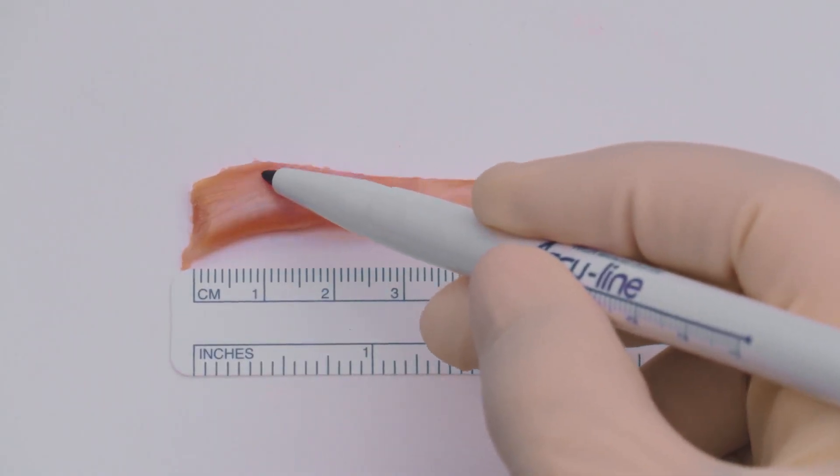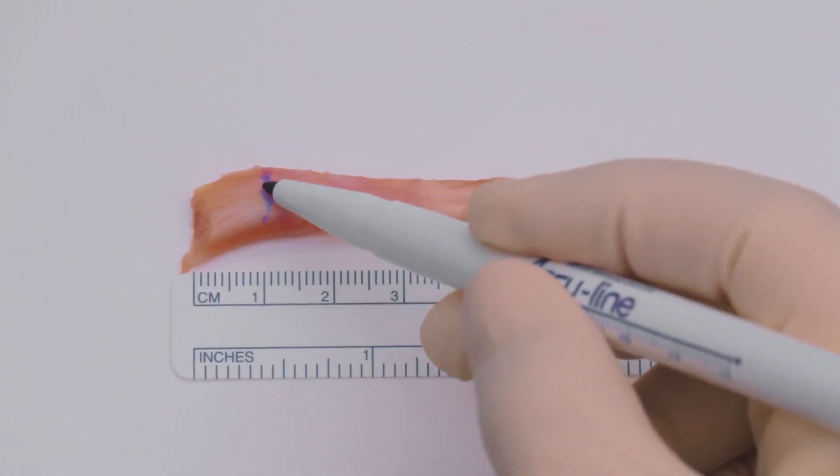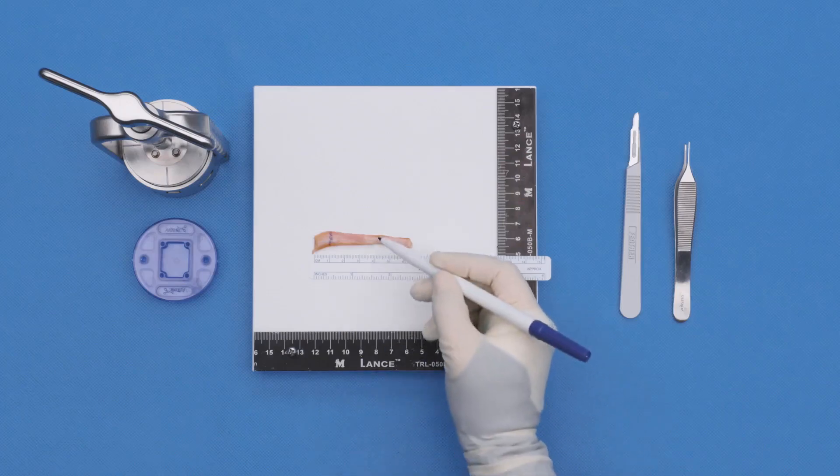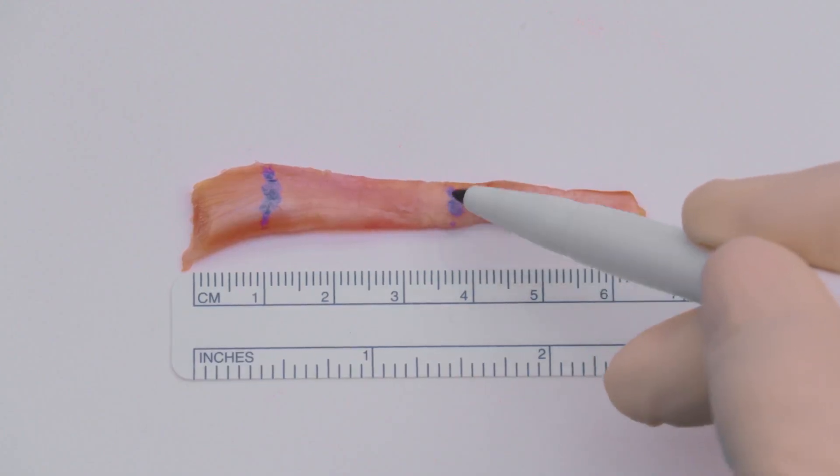For the graft, harvest the biceps tendon through either a super-pec or sub-pec approach. It is recommended to harvest at least 40 mm of tendon.